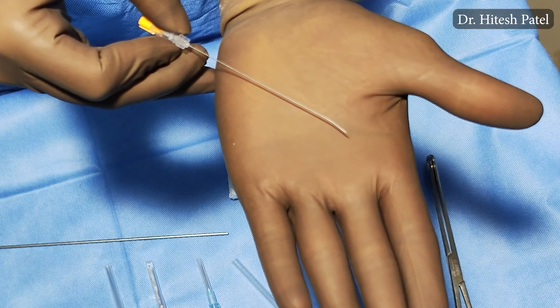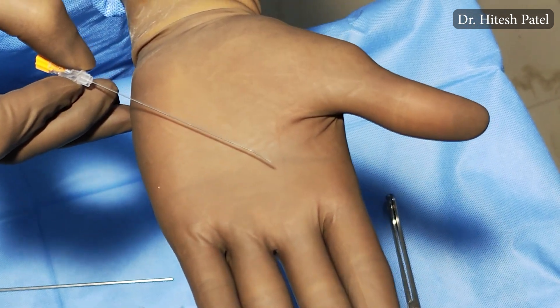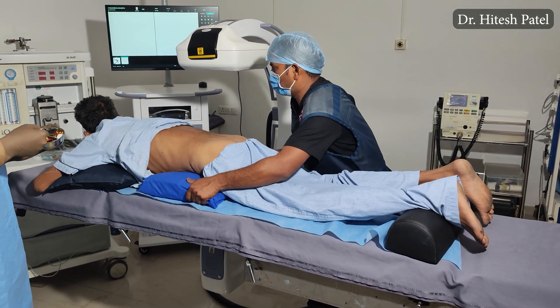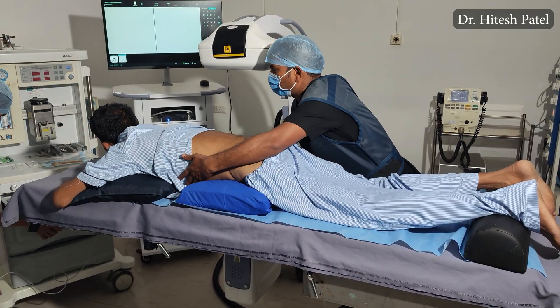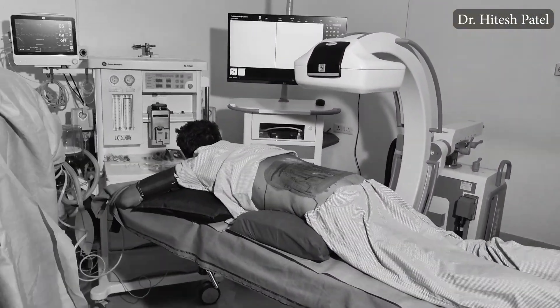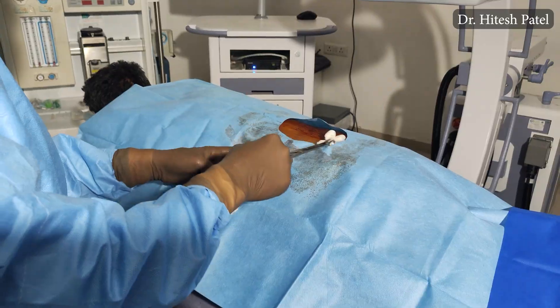You can see the angle I have put on the spinal needle. Some people do more angle, some do less. Initially, a little more angle is okay when bending the spinal needle. Now let us go to the patient. For the lumbar transforaminal epidural procedure, we need the patient in the prone position with a pillow on the head, lumbar support under the abdomen, and leg support. We have to adjust the lumbar support according to the comfort of the patient. This patient is having left-side radicular pain, so we will do the left-side L4-5 root block.